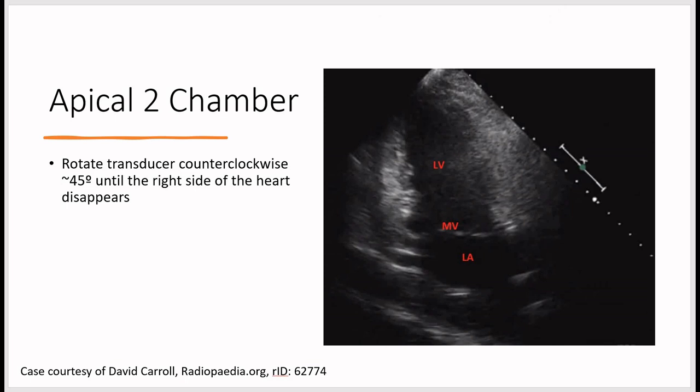The apical two chamber view is obtained directly from the apical four chamber view by rotating the transducer 45 degrees counterclockwise until the right side of the heart disappears, leaving only the left side. Structures visible are the left ventricle, mitral valve, and left atrium.